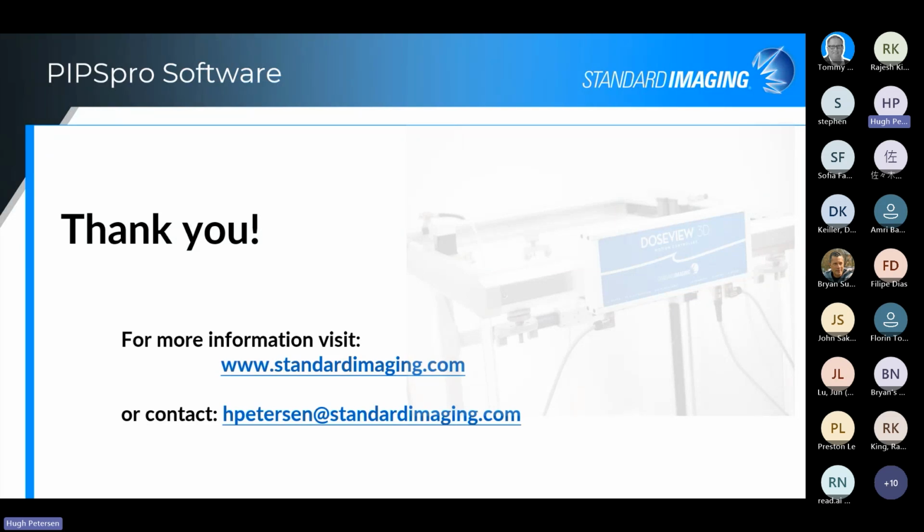Another question someone had asked: do you recommend the raw CT sim images or reconstructed images for the treatment planning system? Basically, we do want to use the raw images out of the CT simulator because that's actually what we're testing. So it's not really how the TPS handles the images, but how the images come out of the CT simulator itself.